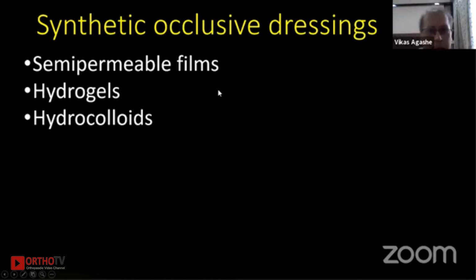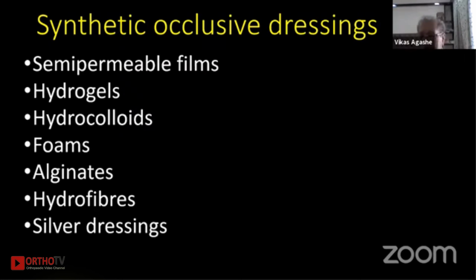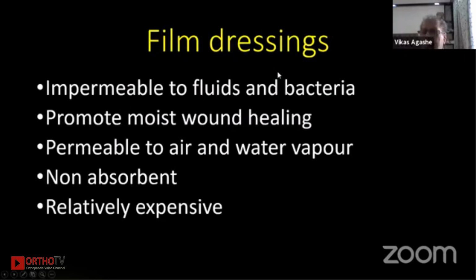They can be hydrogel, hydrocolloid, foams, alginates, hydrofibers. Several types are available. Collagen dressings. So the commonly used are film dressings.